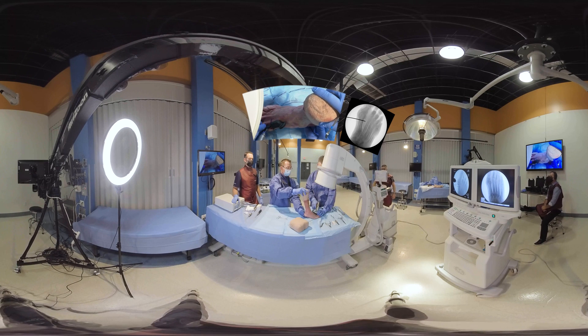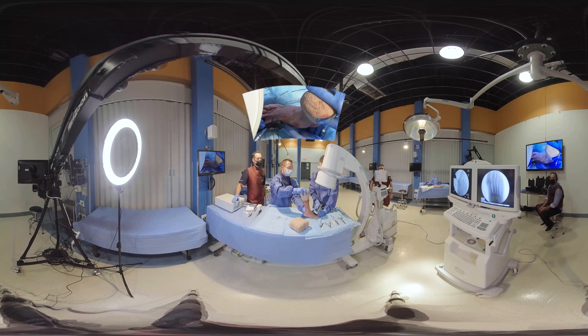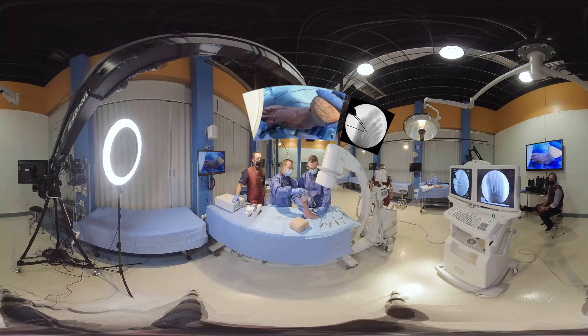So we're in the capital fragment here, so that's going to be good. And we're going to place two wires. This allows us to have a reduction tool after we complete the osteotomy. I think this is a really nice addition to the mini bunion set. One of the trickier parts of this surgery, in my experience, has been having that mobile capital fragment dancing around a little bit.